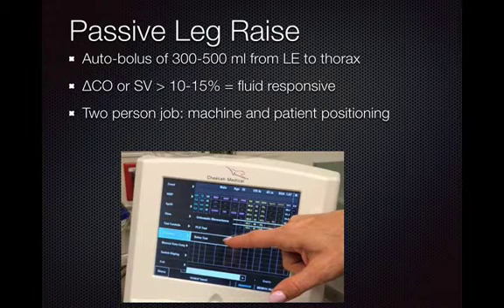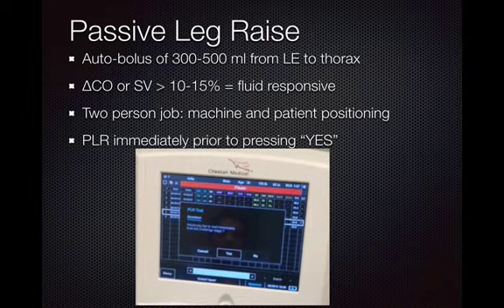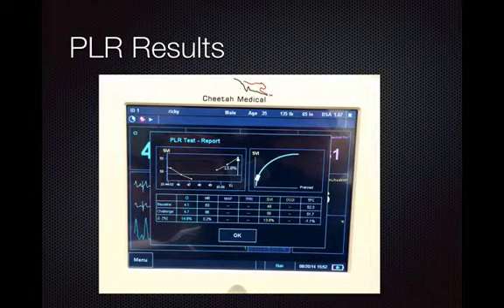To start the procedure on the machine, you go into your menu, go to protocols right here, and select the passive leg raise test right here. When you do that, it'll ask if you want to use the same data that you just collected as the baseline. You want to select yes. Before you select yes, make sure that the patient is in the passive leg raise position, and then hit yes.